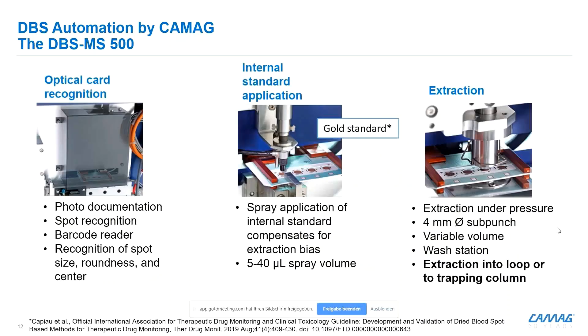Let's take a quick look at the modules. There are three modules basically. First, the card goes into a camera where we scan the barcode and do spot recognition. Depending on the quality criteria, you can either reject or accept a spot, and we also center the extraction cell to the middle of each spot — this is recognized automatically. Then, secondly, we spray internal standards directly on the blood spot.